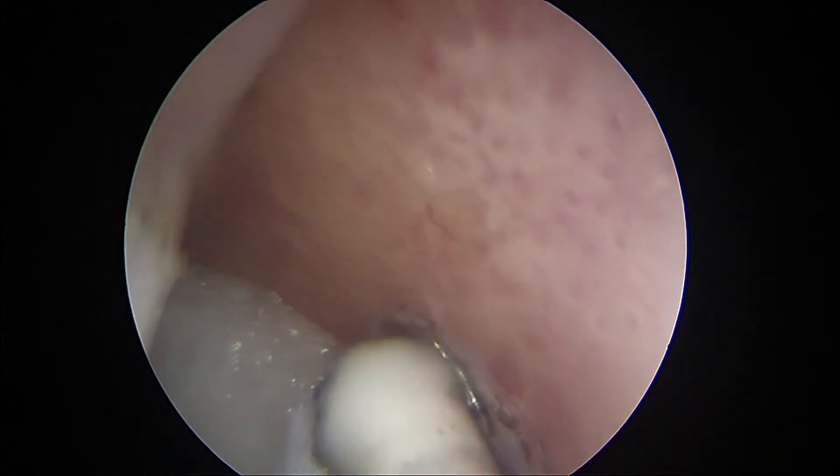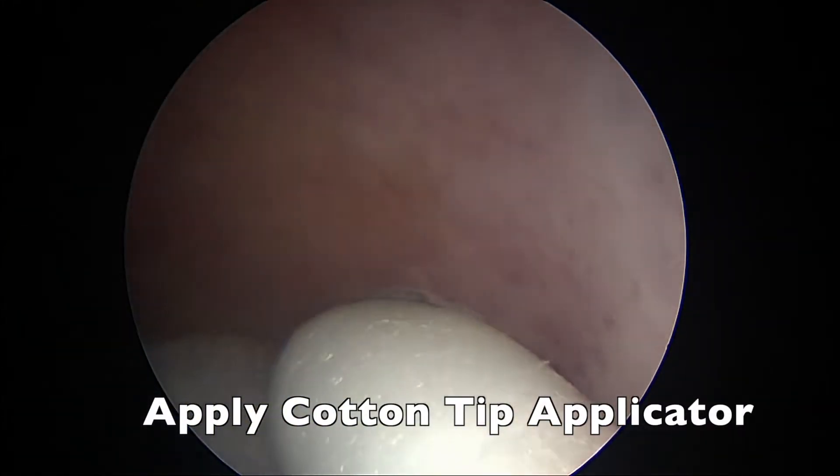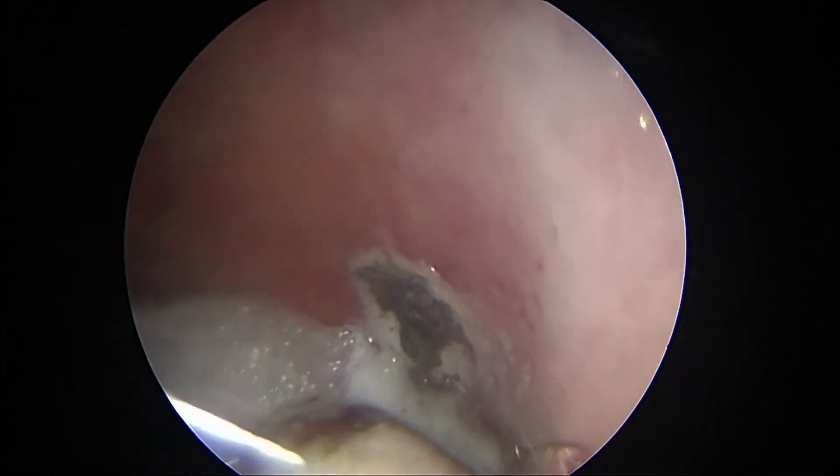After using the silver nitrate, my next tip is to use a cotton tip applicator or Q-tip right over that area. It holds that silver nitrate on that area to allow it to cauterize.